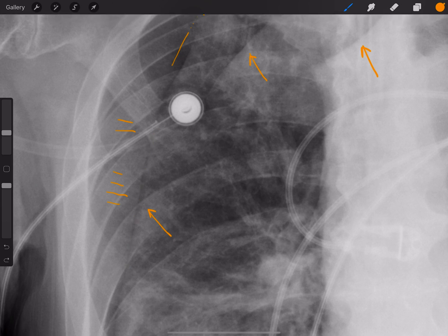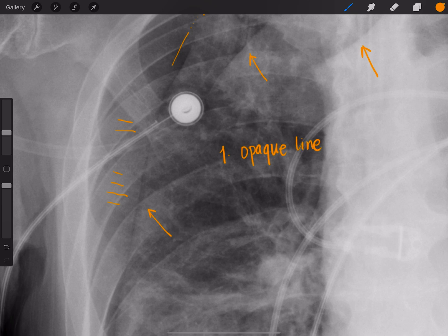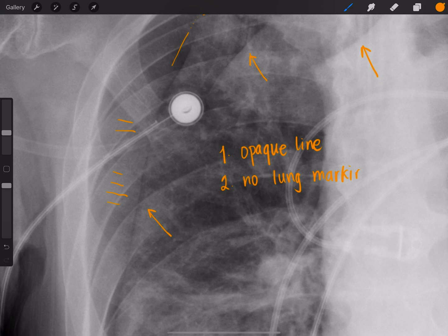So I don't want you to make the mistake of calling a skin fold a pneumothorax. Number one, make sure you're looking at an opaque line, not a lucent line. Number two, you want to see no lung markings past the line. And number three, a real pneumothorax should not fade away like a skin fold will.